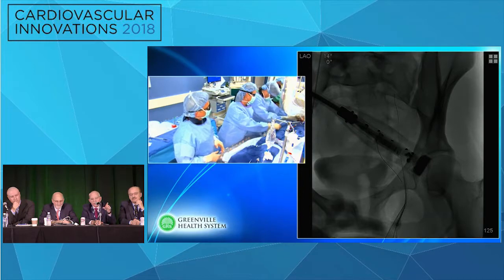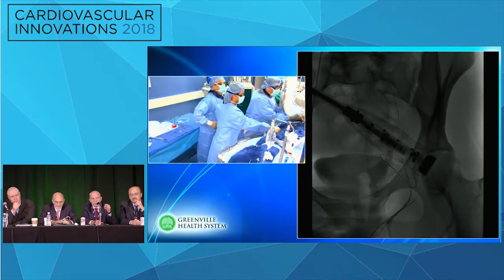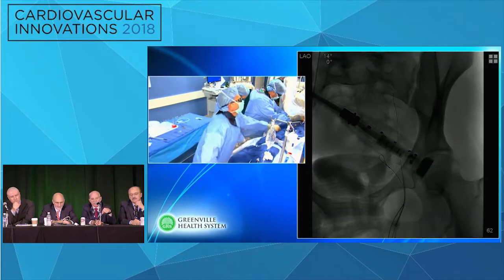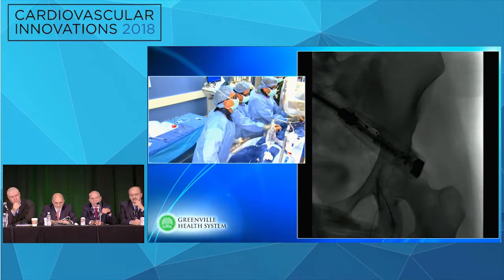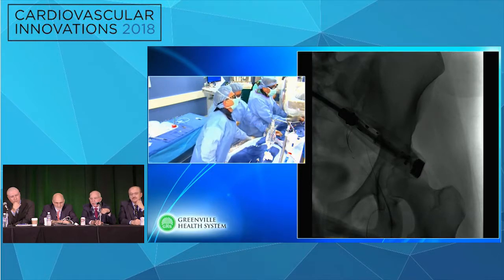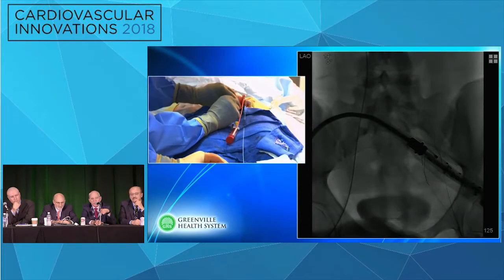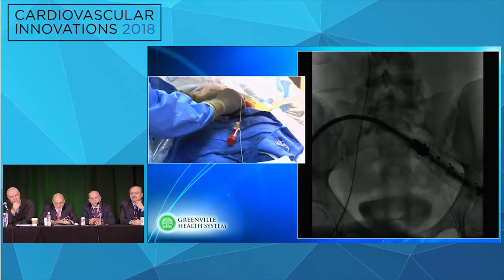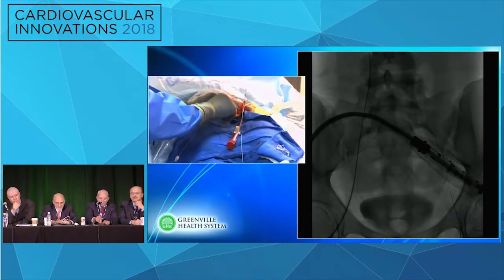The other thing I would tell you though, it's only been a couple of months now that this has been occluded. And again, if worse comes to worse, the other option would be to come from above, either a brachial vein or come above, where you have a mechanical advantage coming down from the IVC on top of that. Even though it looks relatively smooth, with a vert catheter or an angle type guide catheter, you might be able to get enough support to get into that proximal segment of that iliac vein right at the junction with the IVC. And then once you have that directed, it may be easier to get into the true plane where you want to be. So if this doesn't work, I would consider that. That's an interesting thought.